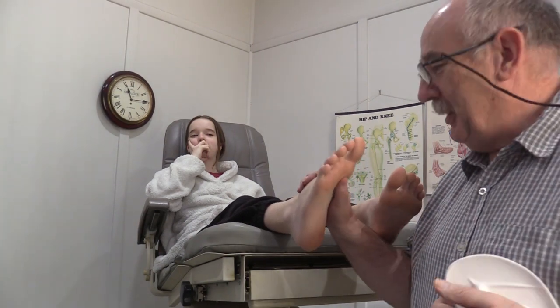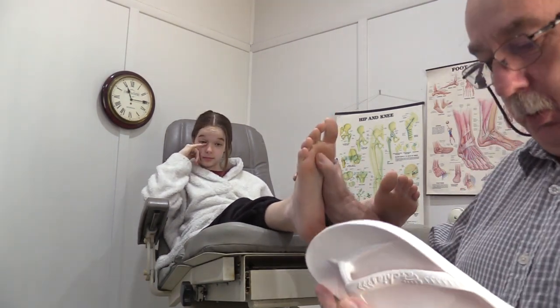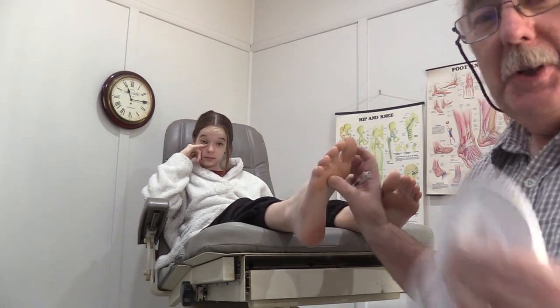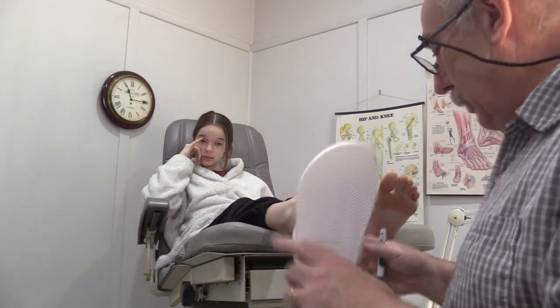This is my daughter Steffi, who has volunteered to be a participant in this little demonstration. I've made no secret of my being a bit of a fan of the MOZI — the medial oblique subtalar inclination foot orthotic design feature — and combined with that, the importance of the subtalar joint axis in prescribing foot orthotics, because as you'll see in this foot here, the axis is quite medial. So what I want to try and do is incorporate a MOZI design feature into these Archie's to make them more comfortable and perhaps more effective.